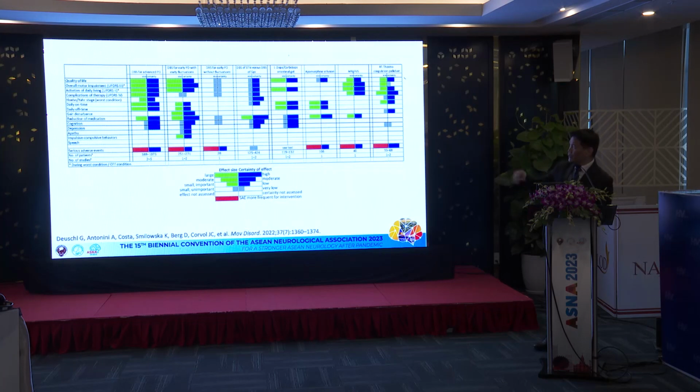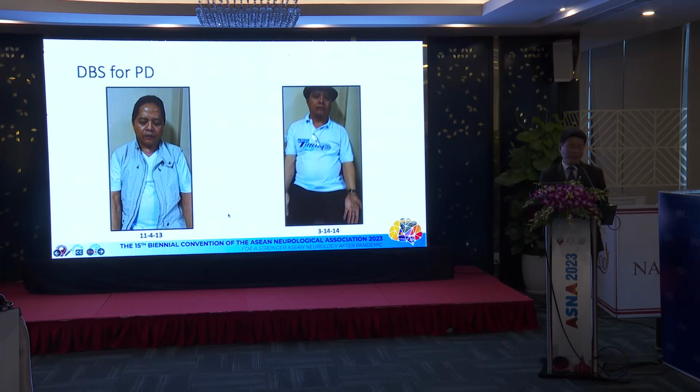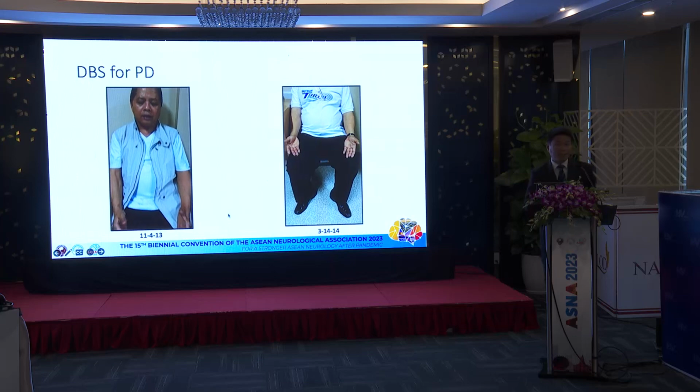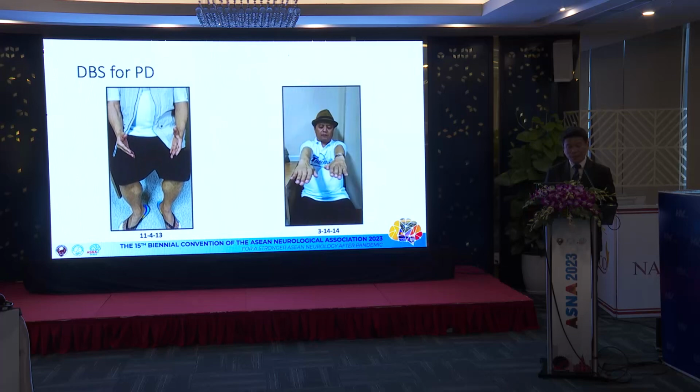And if you look at the quality of life and then down the line, you can download this paper from 2022. So there is a large effect for DBS for advanced Parkinson's in terms of quality of life. And if you look at the focused ultrasound, the effect is not as good, a small important effect. So we all know this patient, and the patient underwent DBS, and the tremor practically disappeared. So he's almost back to normal.